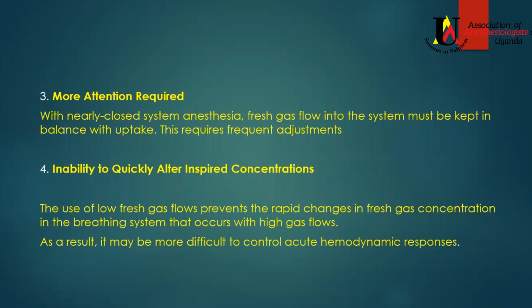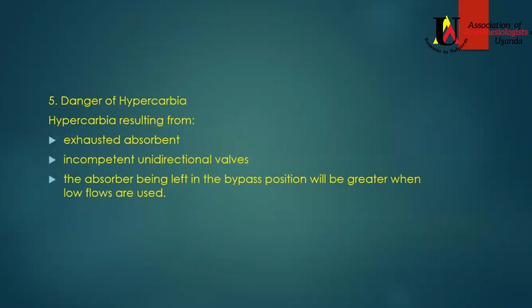Inability to quickly alter the inspired concentration. We mentioned this when I was explaining the time constants, that it's going to take a bit longer for whatever you've changed at your vaporizer to show up as an effect in the patient. So in some instances, if you are stuck, you may increase the flow for a short while, and then you let the effect set in, then you go.